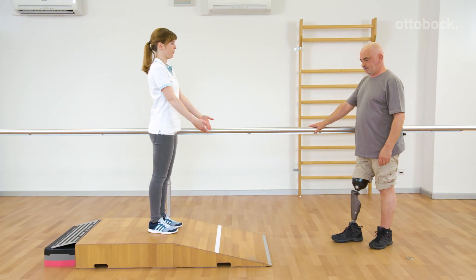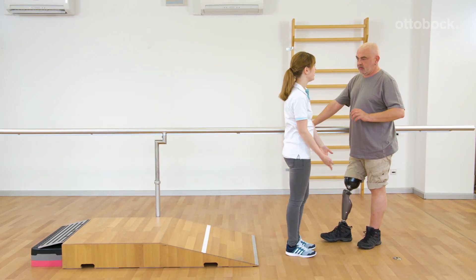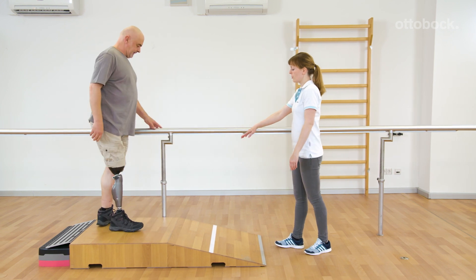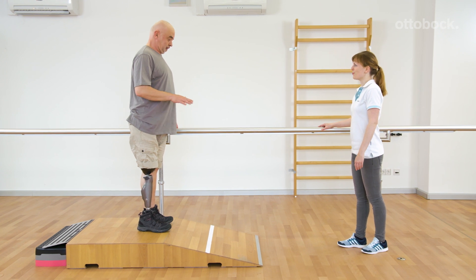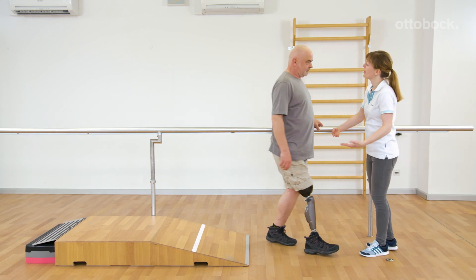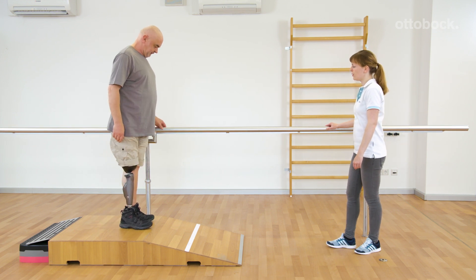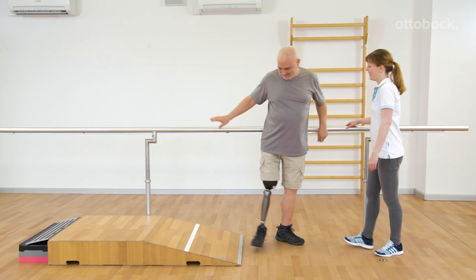Franziska demonstrates how the active knee flexion is used to absorb the landing for small jumps. It is easier to learn the motion pattern on slight slopes because the knee flexion happens nearly automatically. Gerhard should leap over the white marking. The aim is to land as smoothly as possible. Immediately after landing, Gerhard allows knee flexion to occur, or rather slightly yields into the joint.